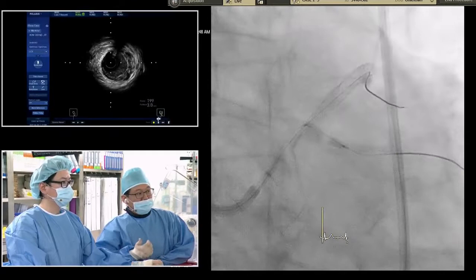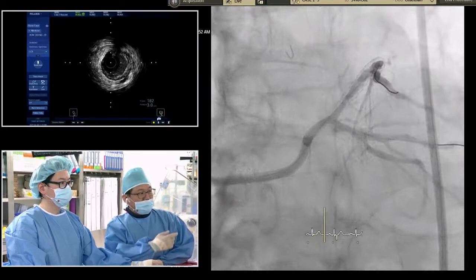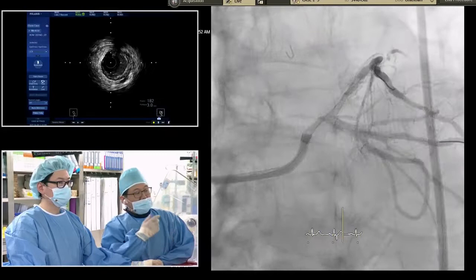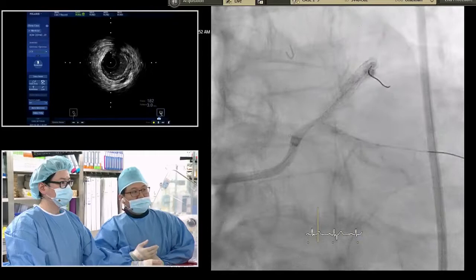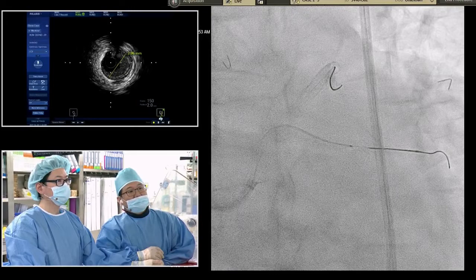Next. Several times, because of weak guiding catheter backup, I use the guide liner. So after several high pressure inflations, using the 2.75 up to 28, I can pass the IVUS catheter to the distal circumflex. So I can see the circumflex for imaging. Very good. Can you see on the screen?